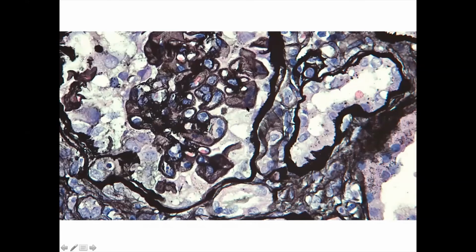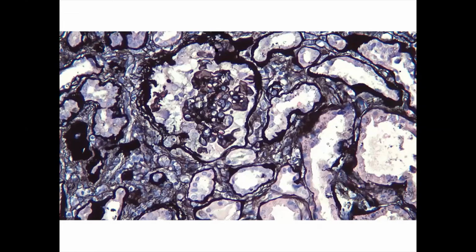Like we said, these are not deposits; wherever there are deposits there is no stain. This is like a negative imprint of where the deposits are. We can see the activated podocytes here, wide and activated. Why are they activated? Because there are immune complexes under them and they are irritated and upset.